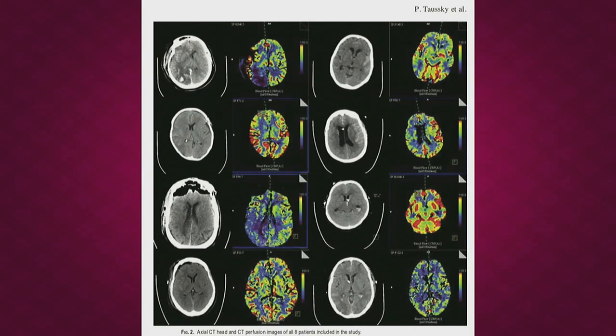The next one below that shows a subarachnoid hemorrhage patient, and you can see a little bit of right frontal oligemia. The third panel down shows a lot of pneumocephalus, so in that patient you're basically measuring atmospheric air that got in there with a craniotomy. We don't know what to do with that data. And deeper in that second panel from the left, you see a big area of potential DCI where cerebral blood flow is reduced, that blue pattern. You're not going to measure that deep.